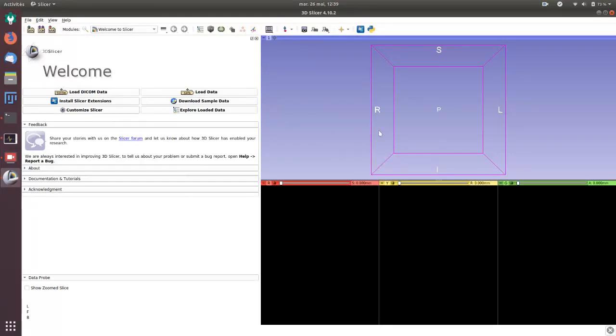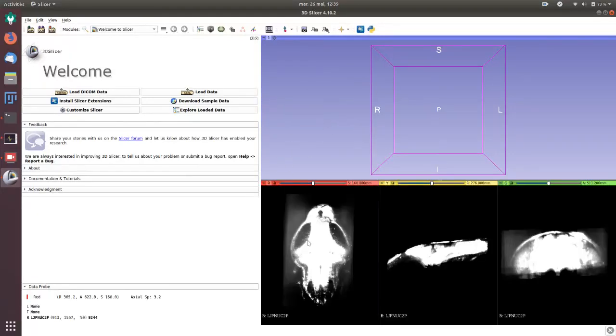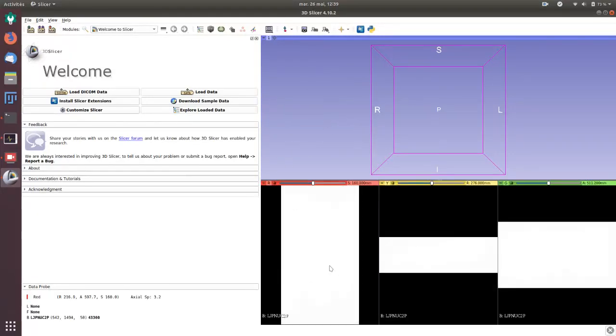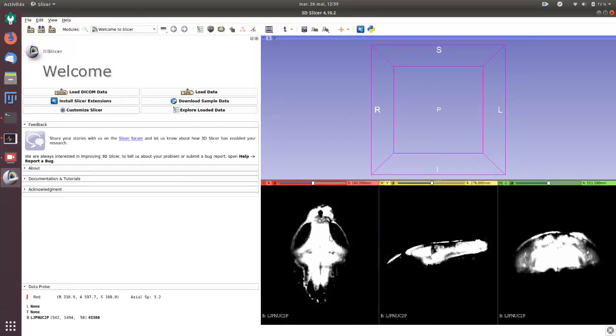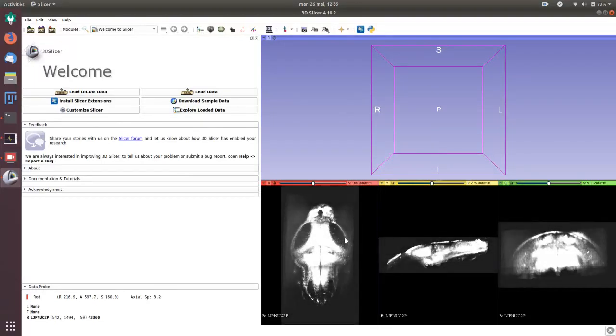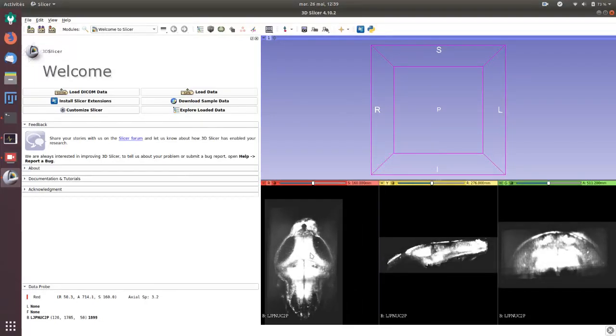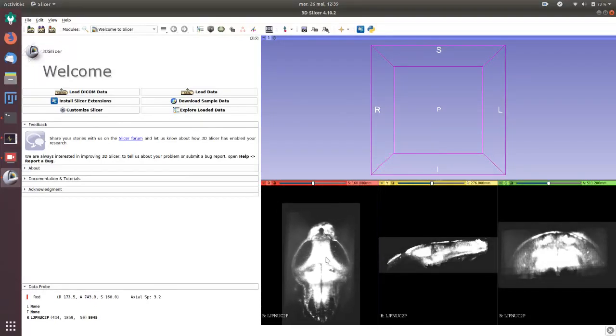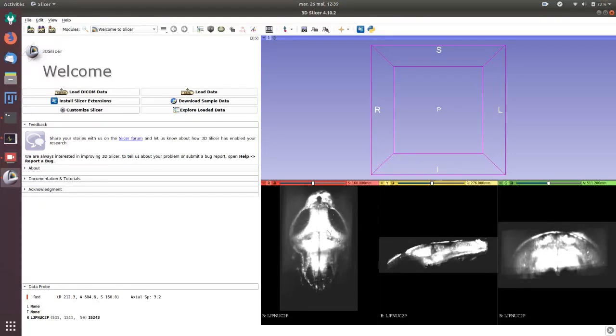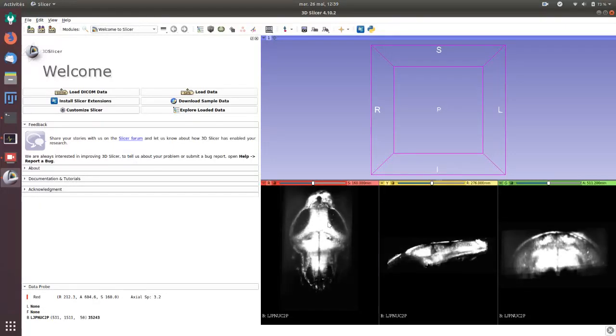I load the data and they will display soon here. We can adjust the contrast by click and drag or move with the middle button.